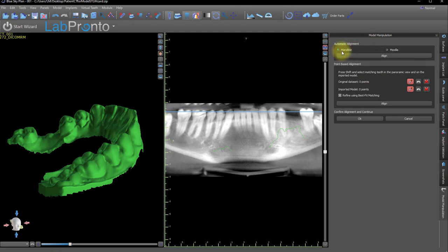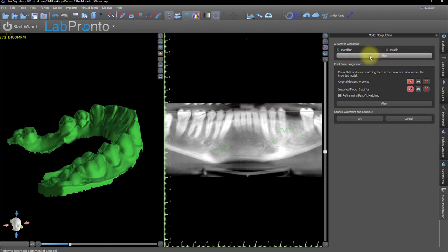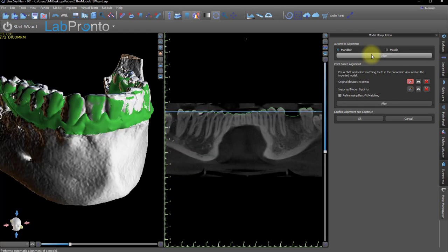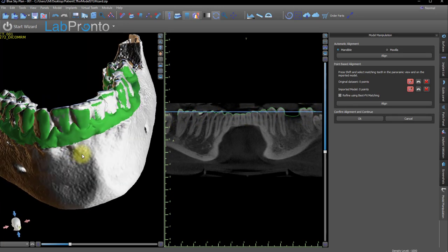The mandible has already been identified. If not, I would simply click on the other radio button. Click Align to start the automatic alignment function. And from the pano, it looks like it's a very, very good stitch. But to be more specific, let's click OK on the alignment.